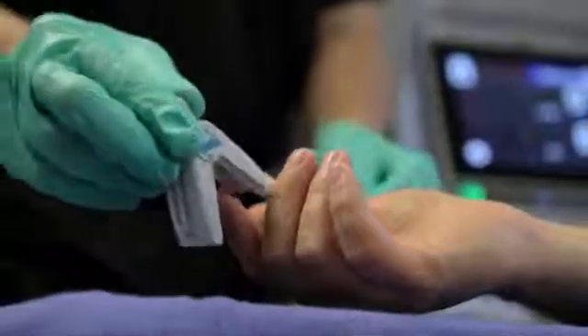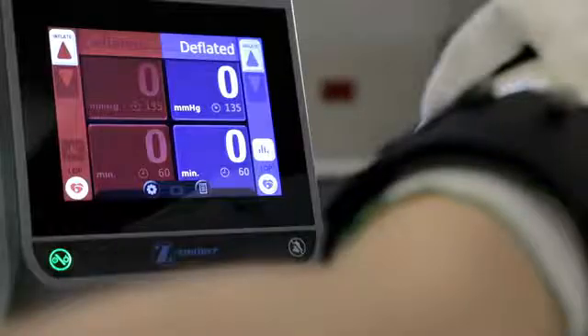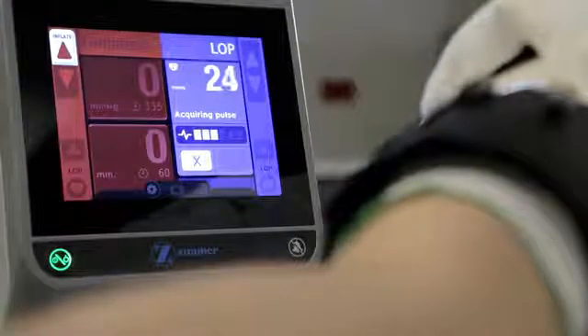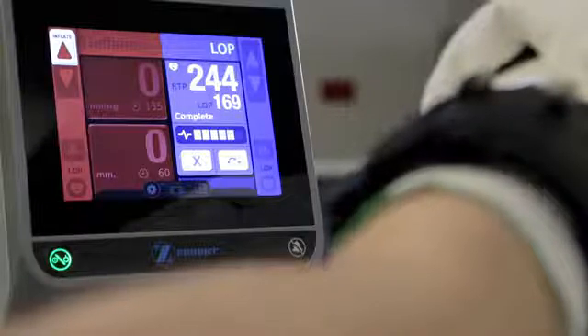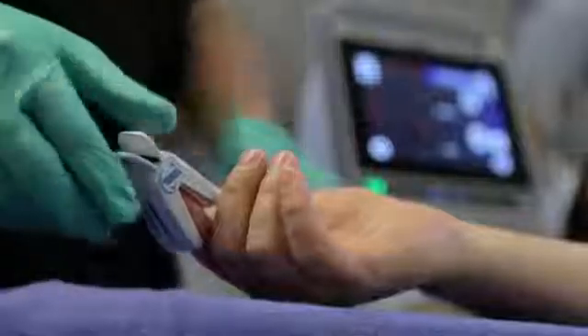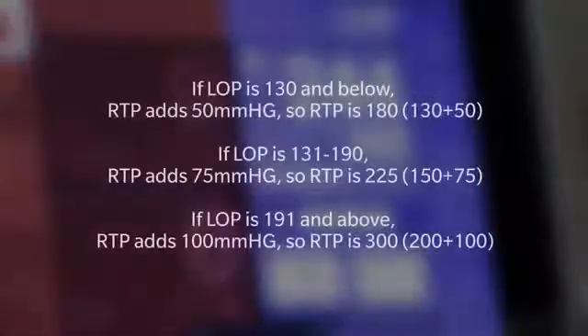For upper extremity surgery, the pulse sensor is typically applied to the index finger of the operative limb. To activate the LOP feature, tap the LOP icon on the display for the appropriate cuff. The ATS 4000 begins to inflate the cuff incrementally until the sensor detects the absence of a pulse in the operative limb. The tourniquet machine then calculates the LOP and allows the cuff to deflate. The LOP pulse sensor can then be removed.